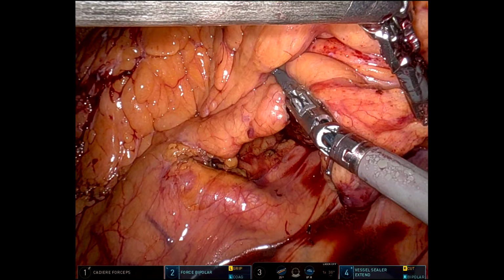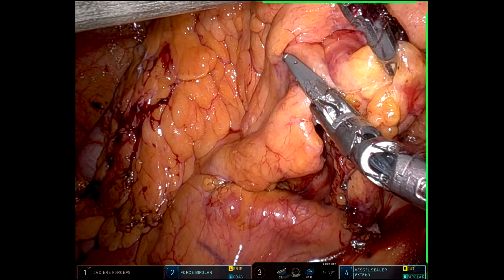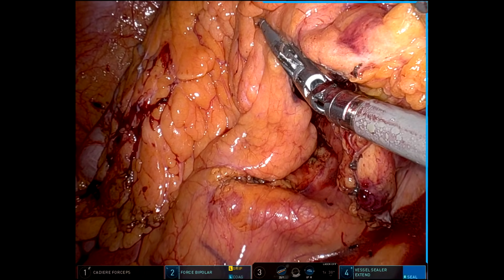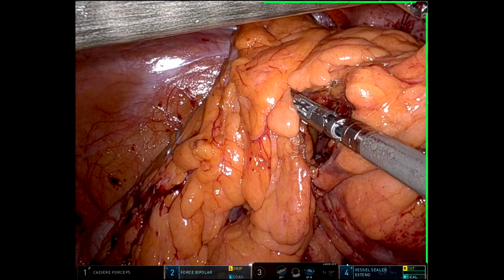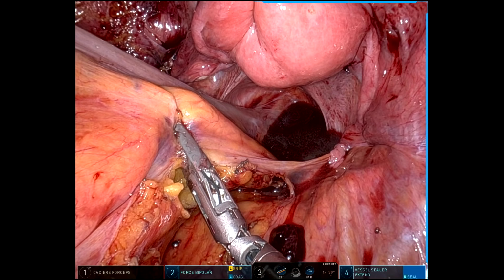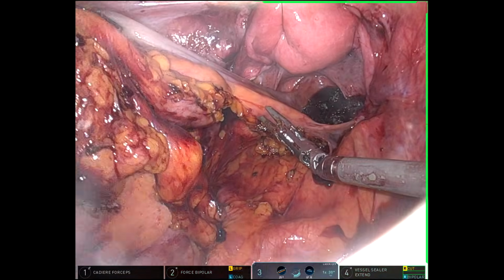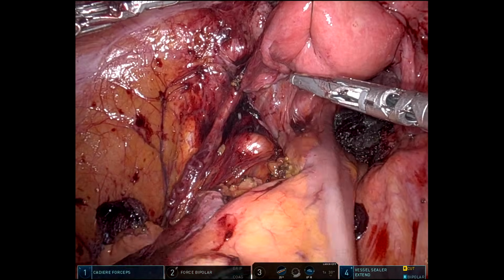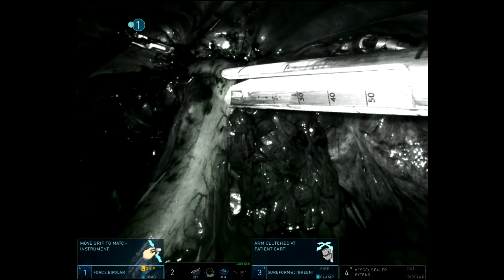But I'll do a transvaginal extraction for specimens that I'm not going to chop up. She had not had a colonoscopy in many years, and on the off chance there's an occult cancer, I won't morcellate it. So I'll do a transvaginal extraction because I know that just about anything will fit. In a man with a case like this, I probably would have made a Pfannenstiel and not done a transrectal extraction just due to the size of the phlegmon and not wanting to morcellate the specimen.